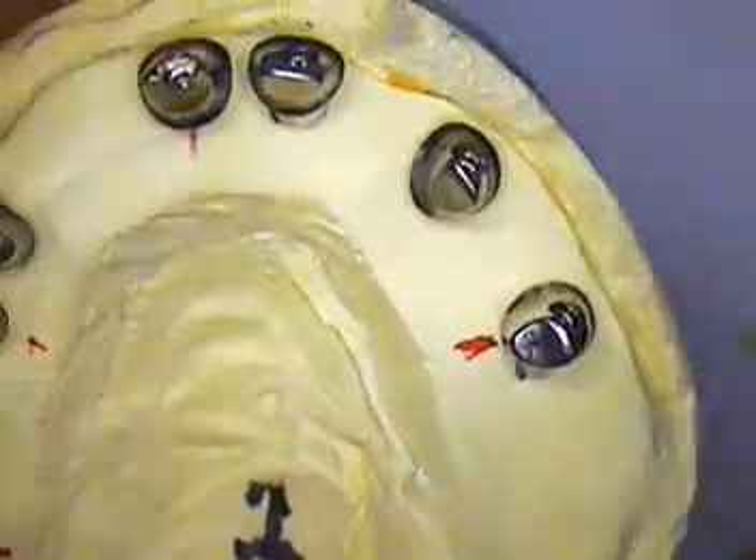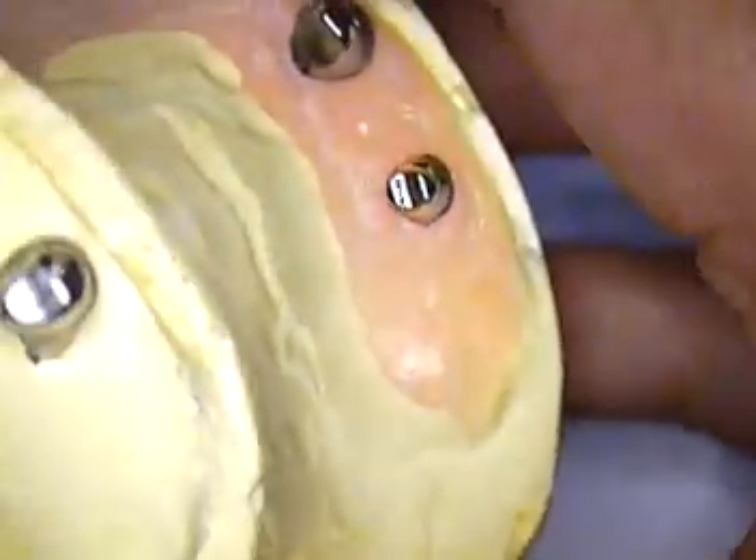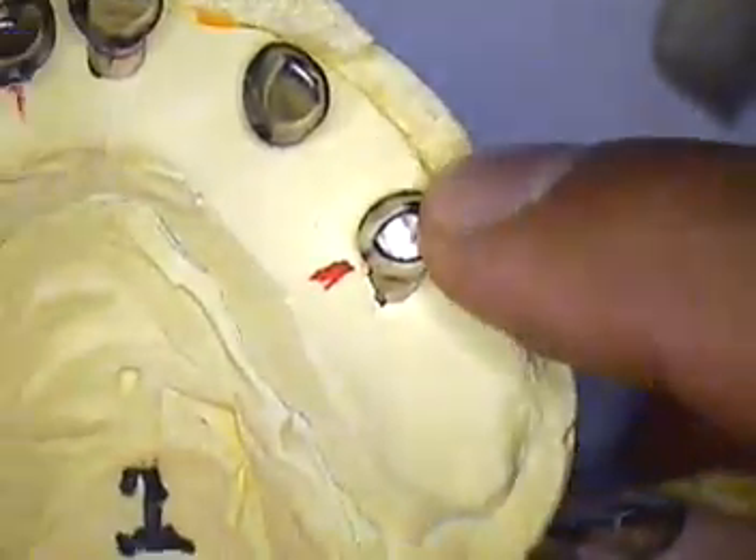So we changed that and went with new abutments. The company sent us another set. Here's the first set and here's the new second set. You can see how much more wide this second set — this particular abutment — was.